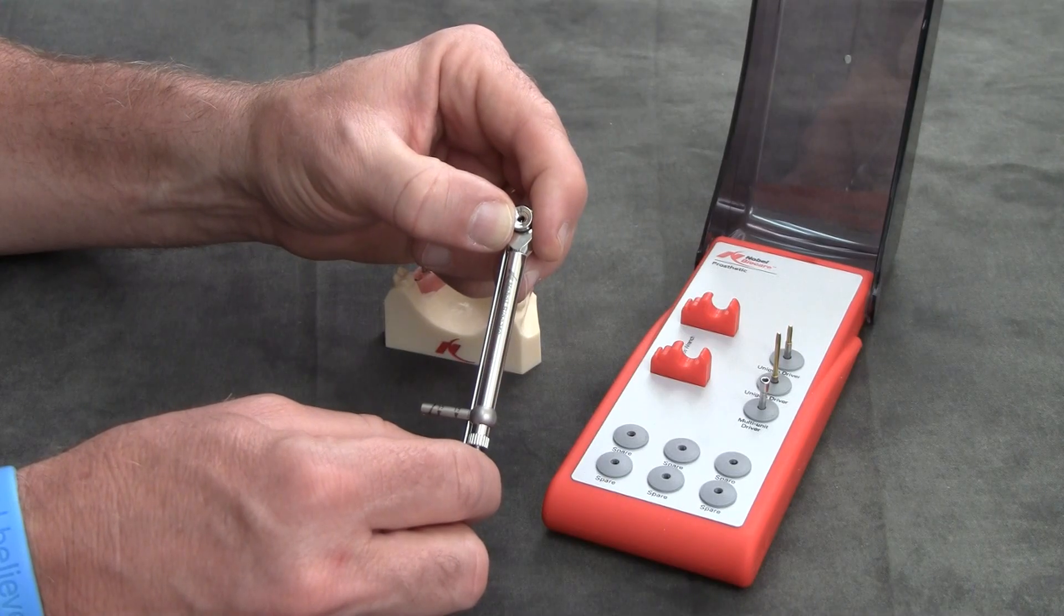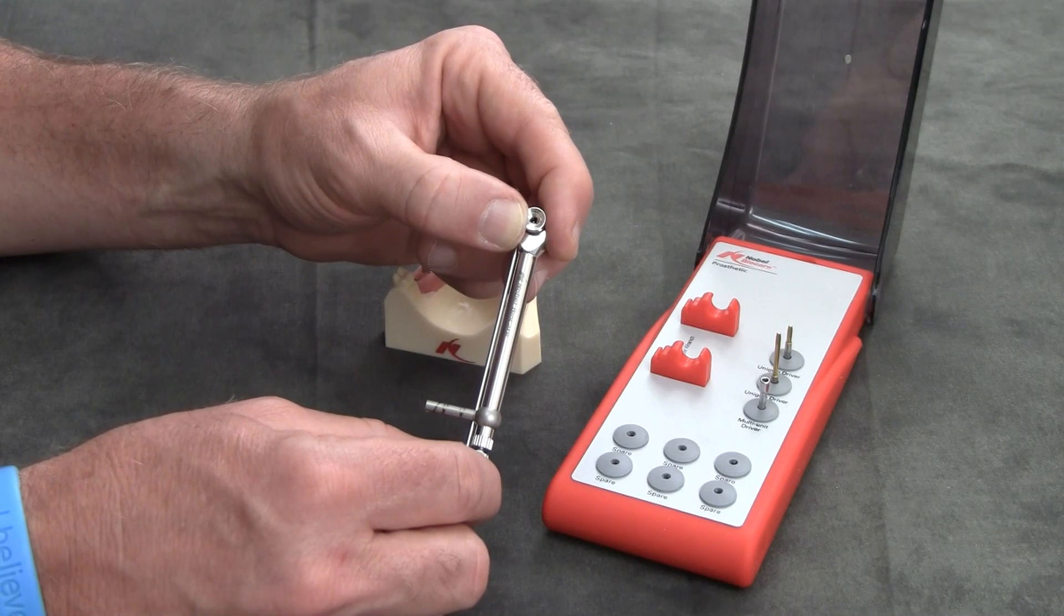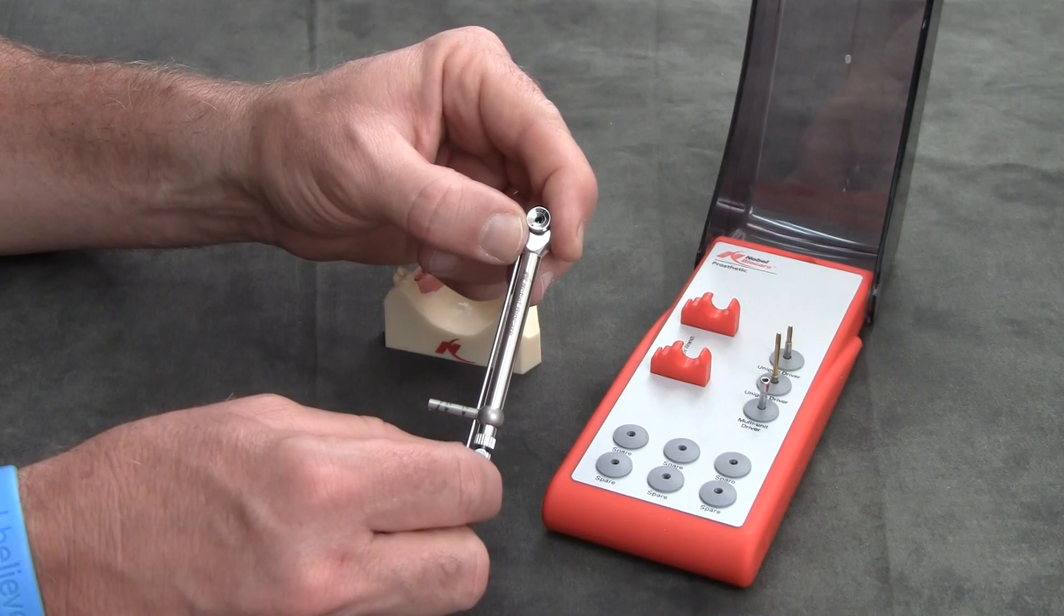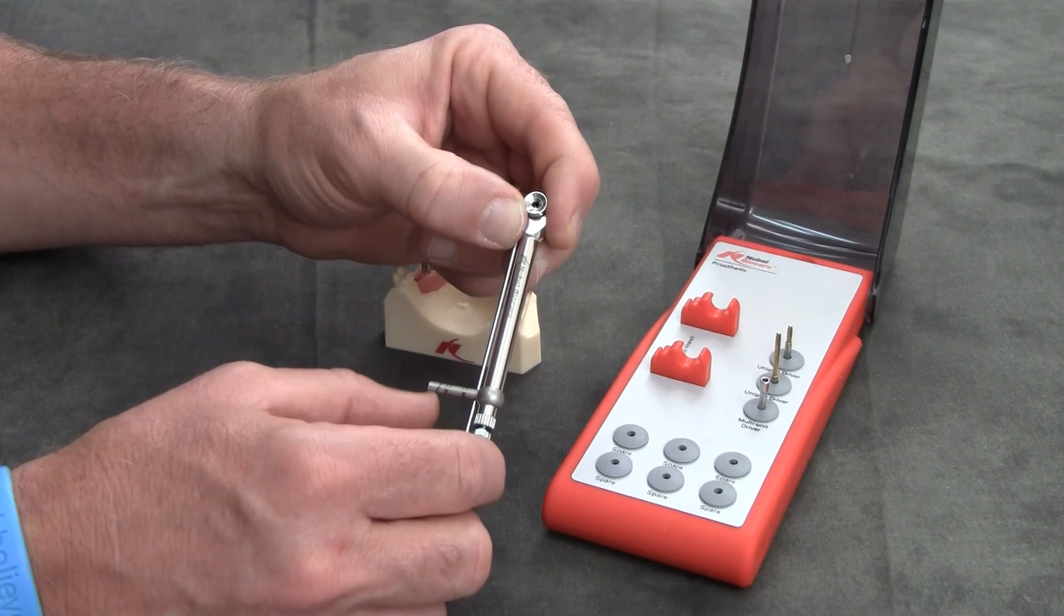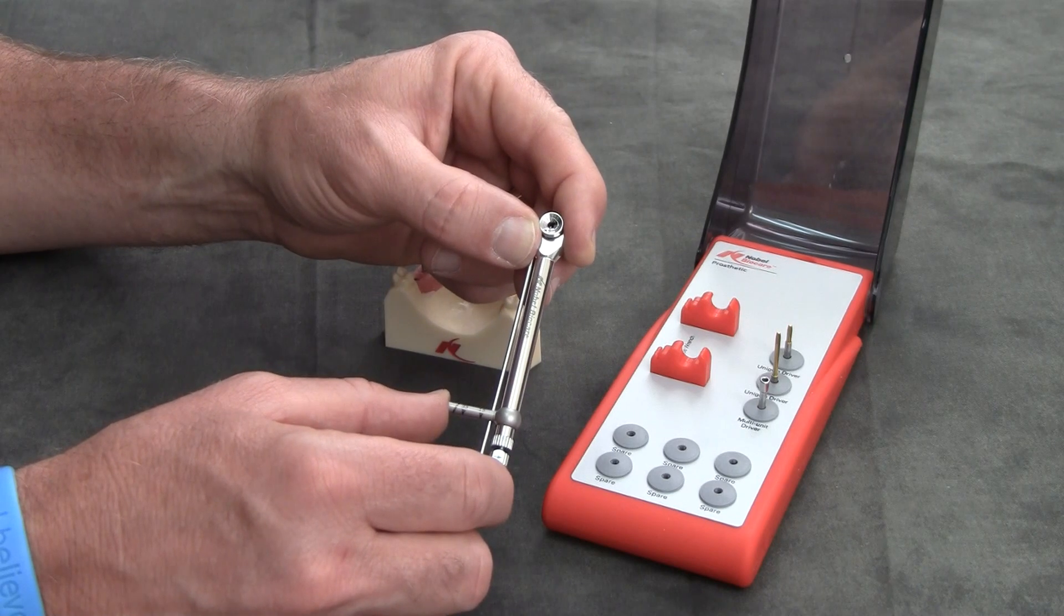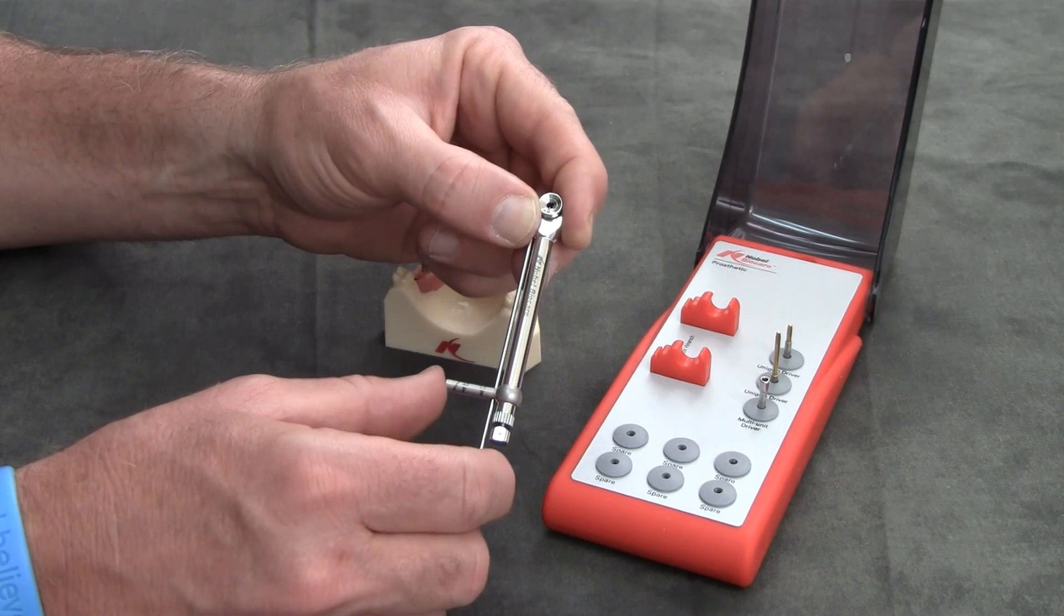You can either over tighten and strip a screw or under tighten and have a loose fitting restoration, which can really lead to a rough day at the office trying to get to that screw. It's best to utilize the torque wrench.